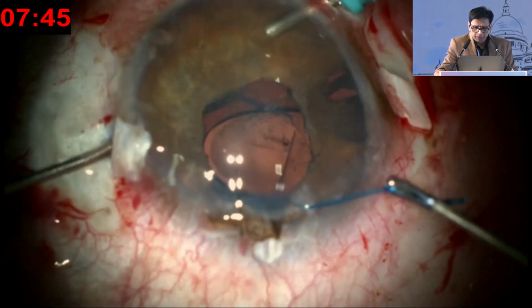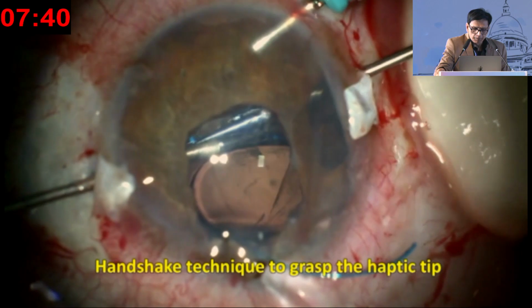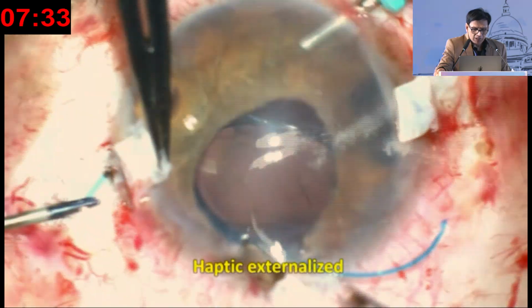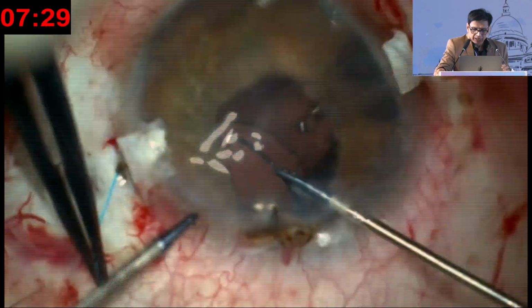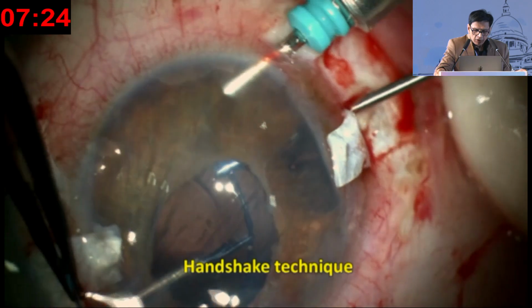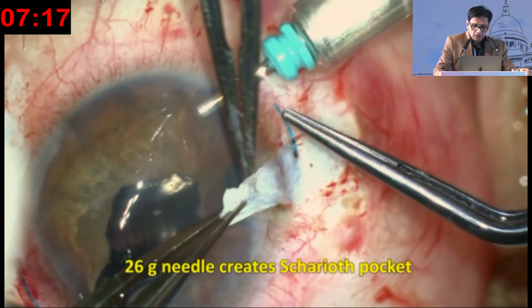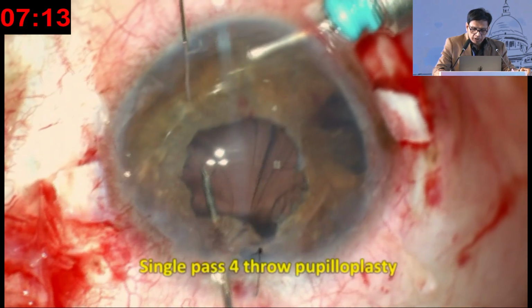Once I've done vitrectomy, I'm now going to catch the haptic, and I'm going to do the handshake technique again. So you see I'm transferring it from one haptic to the other, catching the tip of the haptic and externalizing. So far so good. Now I go in for my handshake technique. So you see now I'm transferring it again from one hand to the other. This is the no assistant technique also which we use, and both haptics are externalized. Once both haptics are externalized, I tuck the haptics into the pockets that Charier's 26 gauge needle creates.